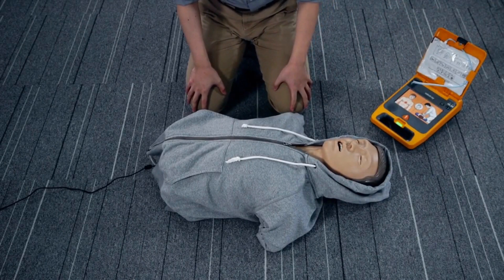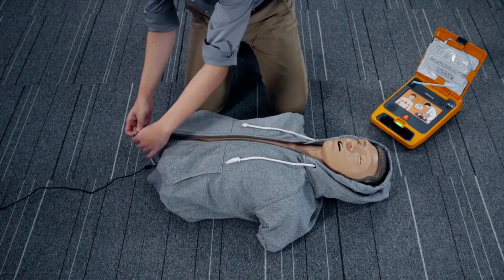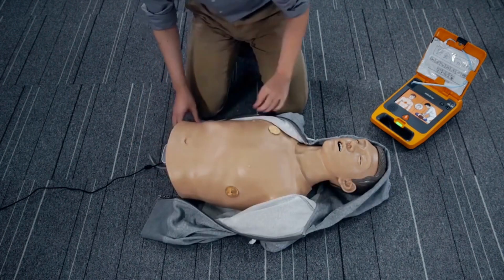Powered on. Stay calm. Remove clothing from patient's chest. Apply pads as shown on pads.